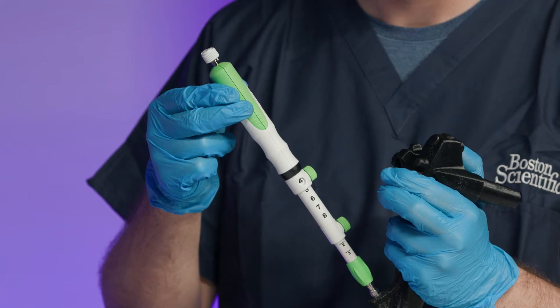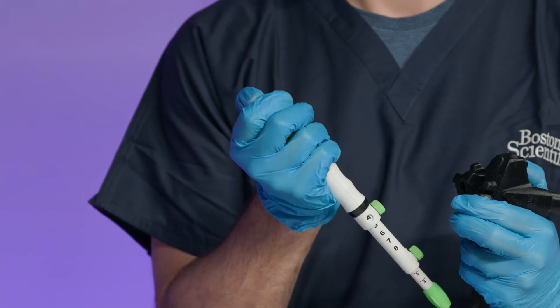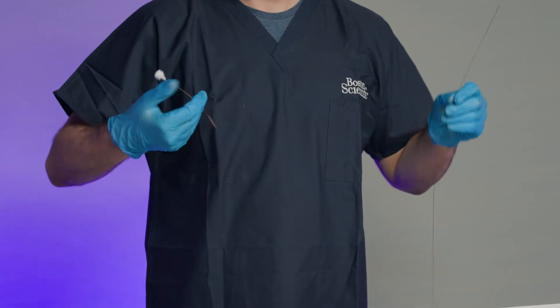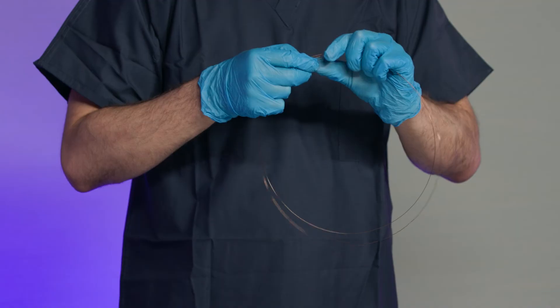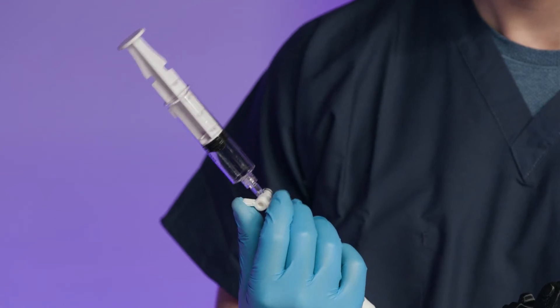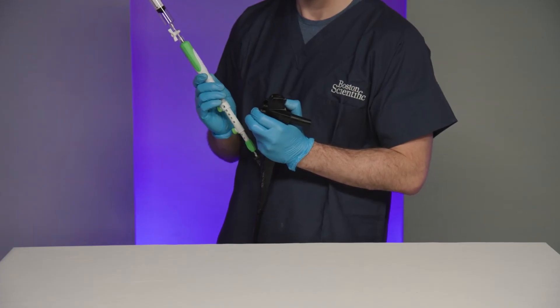Advance the needle by sliding the handle towards the echoendoscope in a slow and controlled motion to penetrate the target site while observing the ultrasound image. Remove the stylet from the aspiration port of the device by gently loosening and pulling it from the device handle. The stylet can be coiled and clipped together using the clip mechanism on the stylet cap. Connect the prepared syringe to the aspiration port on the device handle and turn the stopcock to the open position to apply suction. Maneuver the needle within the target site to maximize sample collection while observing needle penetration on the ultrasound image.